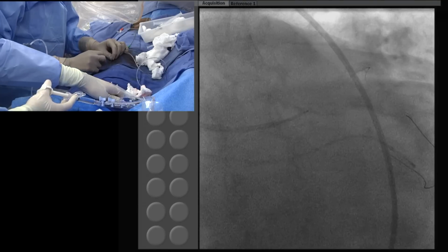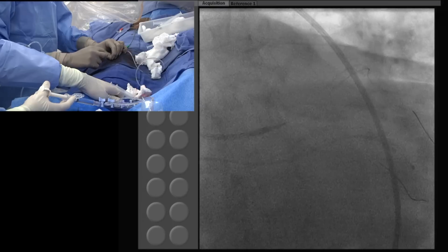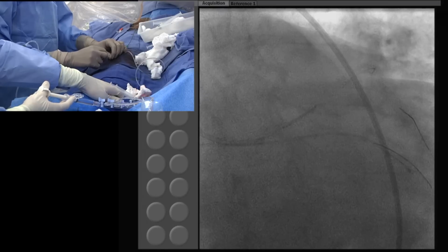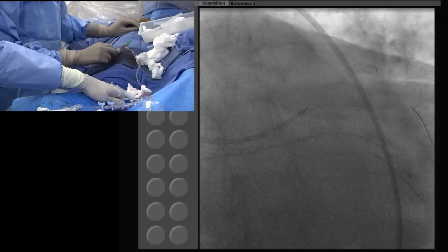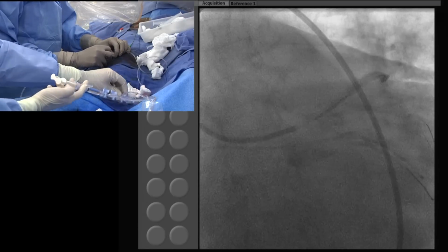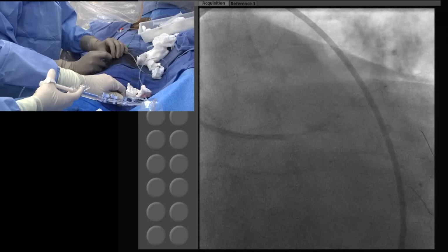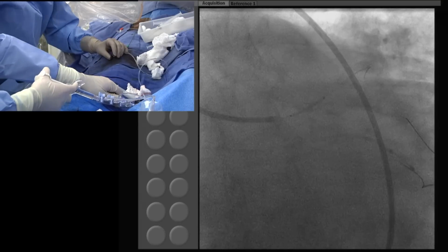Did we dilate that LAD? No, we didn't dilate it. Not at the origin. I think we just focused on the left main. But that was a 12 balloon, no? Yeah. Okay, show some dye so that gives us an idea. What balloon do we have? Get the 4 balloon. Oh, wait. That balloon again. Yeah, it went in. Wait, you want to take a picture? 3.5. Okay. Make sure it's fully covered.